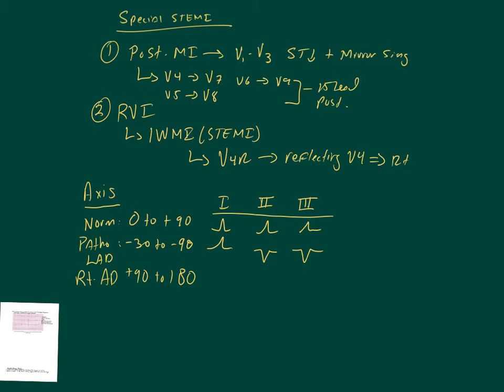Down. No. Down. Oh, yeah. Down, up, right? Because it's shifting away from lead 1. Because remember, if I draw my little circle around the heart, lead 1 is at 0 degrees, right? And then lead 2 is at plus 60, that's 2. Lead 3 is at plus 120. If I have right axis deviation, where is the arrow? It's pointing kind of in this direction here, right? So it's going to be going down, down, up. Yeah, it's going to be going toward 3, 2, but totally away from 1. So down, up, up. And that makes sense why? All right, good. So down, up, up.